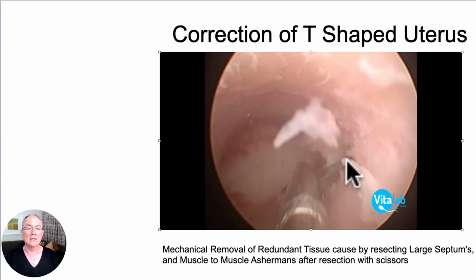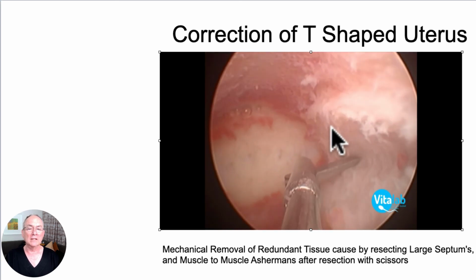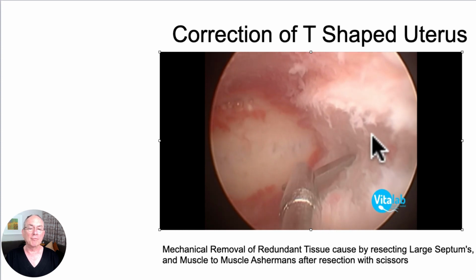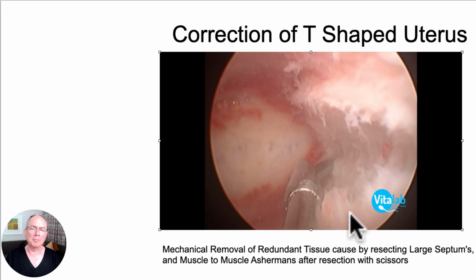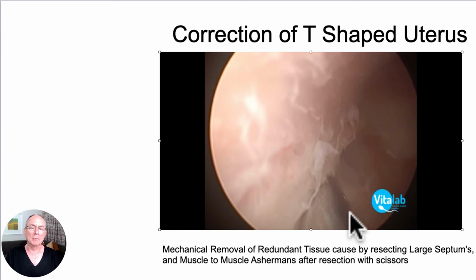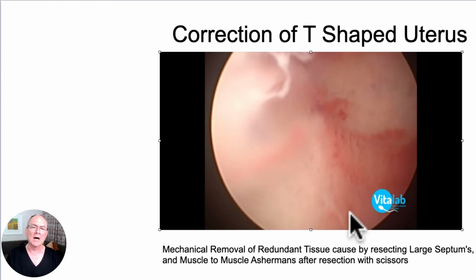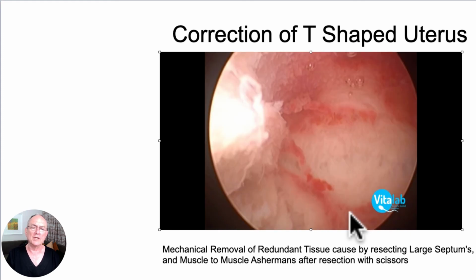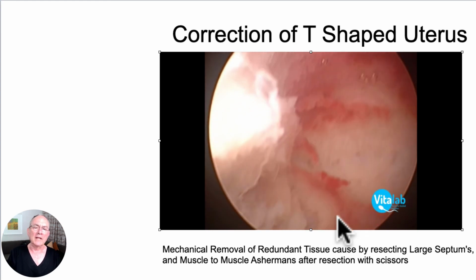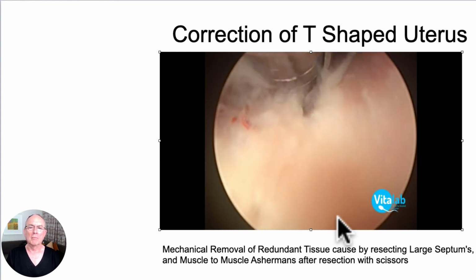There you can see this thick extra fibrous tissue that we have, and I then use the Medtronic to completely clean this up for me, and I then give the patient post-operative estrogen for a minimum of 2 weeks. I usually use 3 weeks, and in the last week I give them sequential progestogens to then allow them to have a normal period, and they then follow up with an HSG to assess the outcome of my surgery.